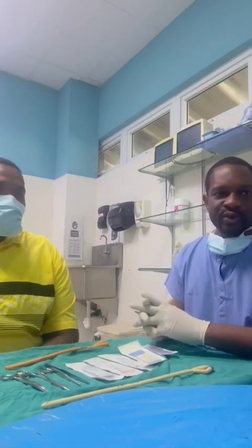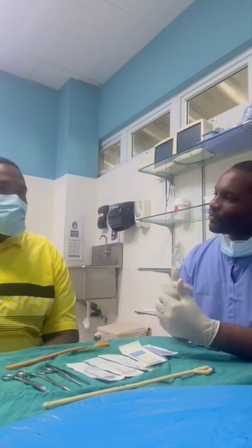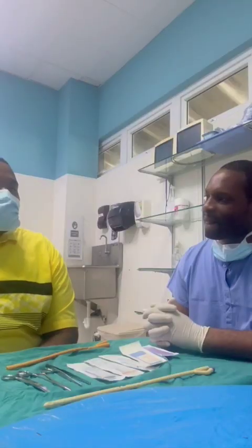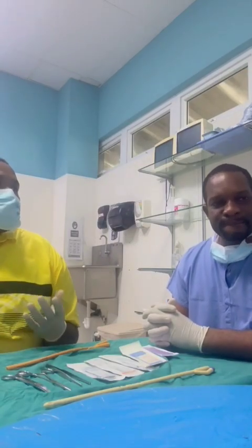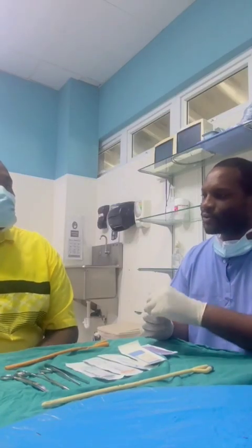So tell me, what are the different types of sutures you're aware of? The types of sutures I'm aware of are monofilament versus polyfilament. I know about absorbable versus non-absorbable sutures. I know about natural versus synthetic sutures. Very good.